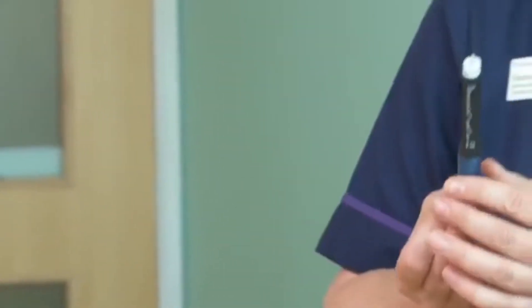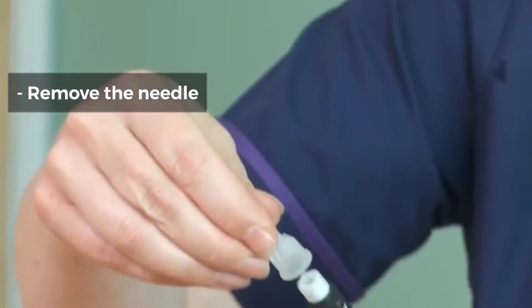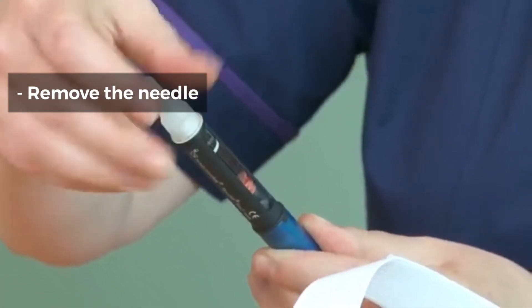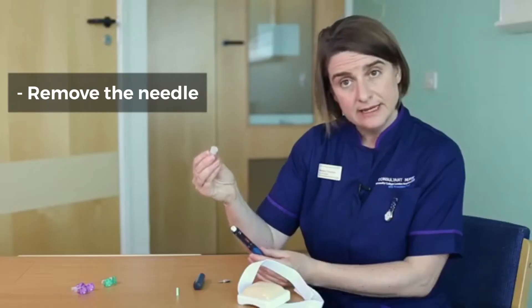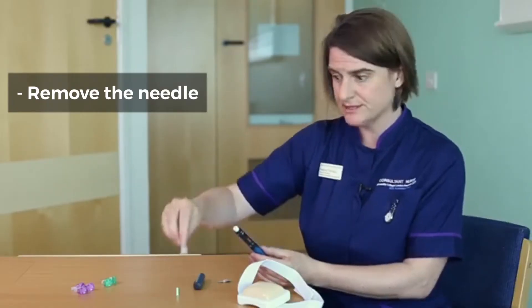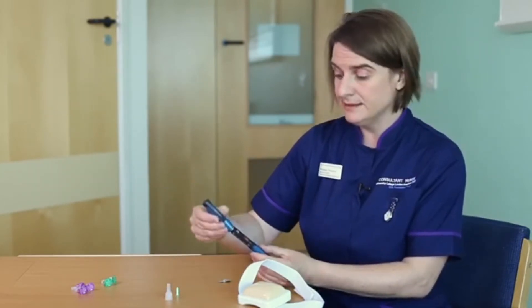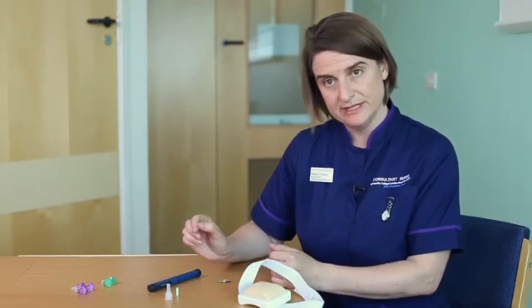To remove the needle from the pen, use the plastic cover and carefully place it back on the pen and twist off. The needle can then be disposed of in your sharps box. Put your pen lid back on and you've done your insulin injection.